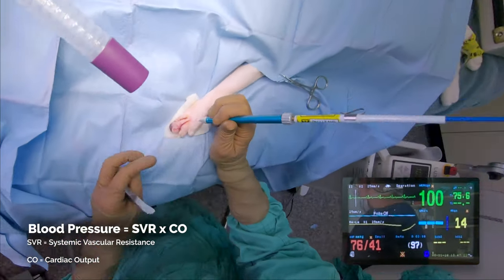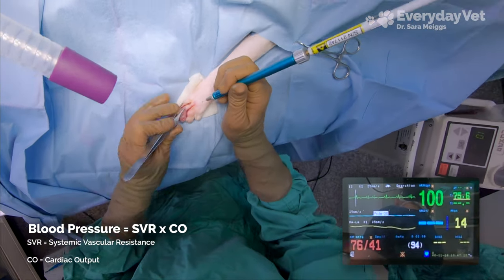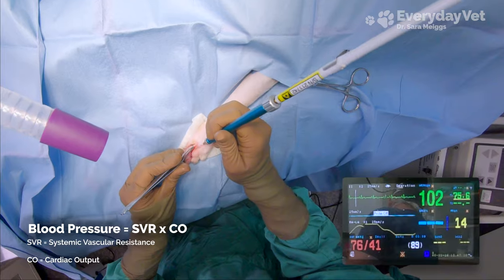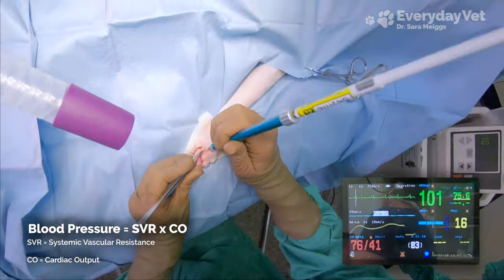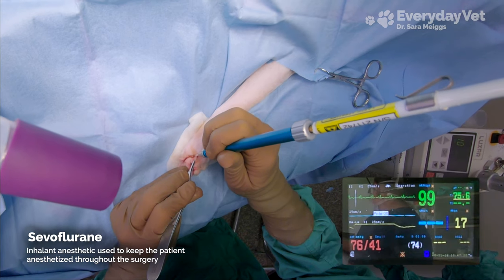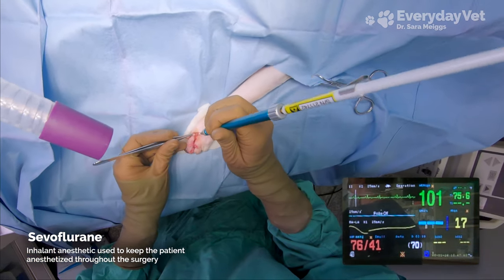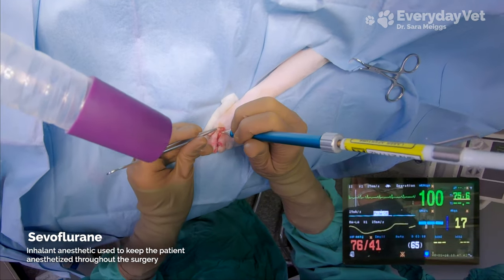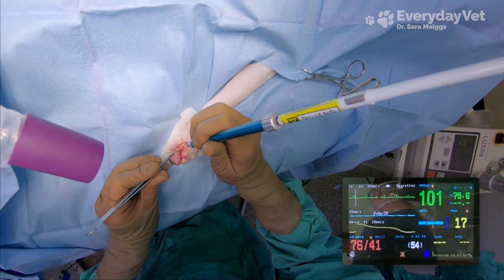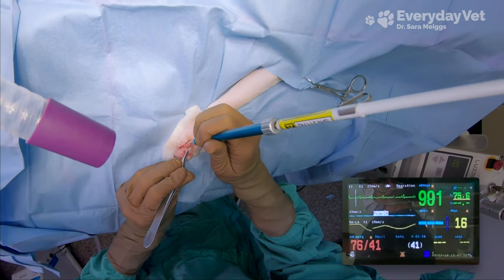Blood pressure is determined by the cardiac output and the resistance along the blood vessel. The anesthesia is causing the low heart rate, which reduces the cardiac output, and it is also causing the vasodilation, which is reducing the vascular resistance. By turning down the sevoflurane, I can counteract both of these effects. The heart rate monitoring is a more complex discussion that I'll cover in the next episode, but just know for now that I want the heart rate to stay above 100. Because both heart rate and blood pressure are low, my assistant is turning down the inhalant gas.